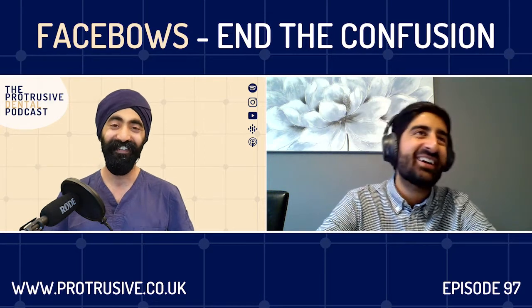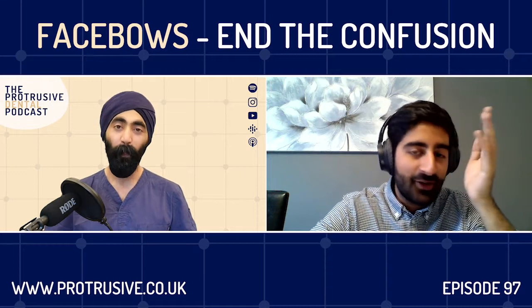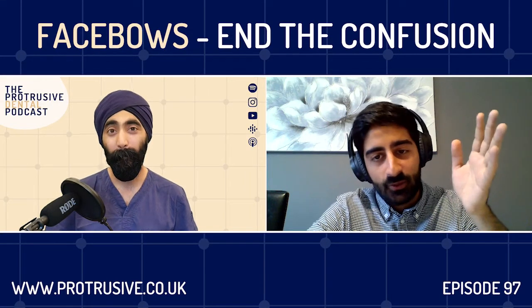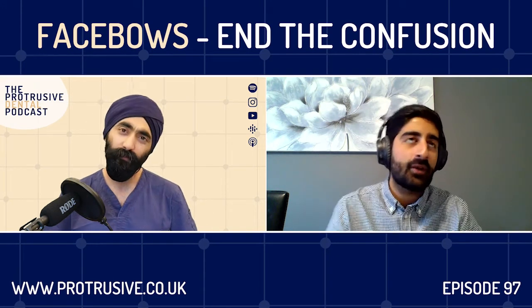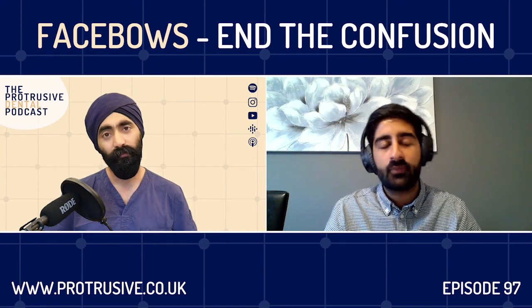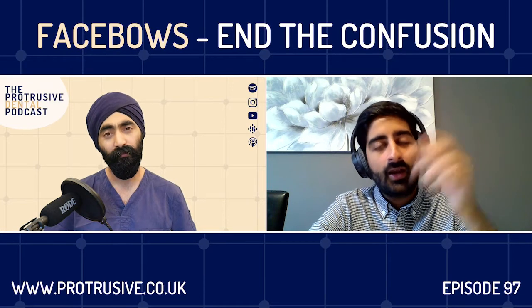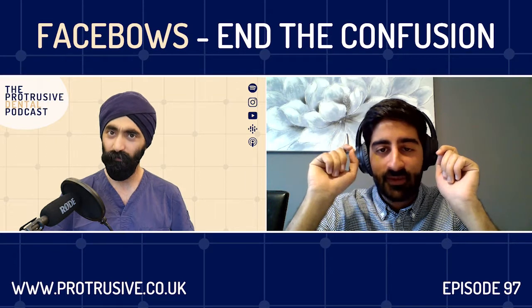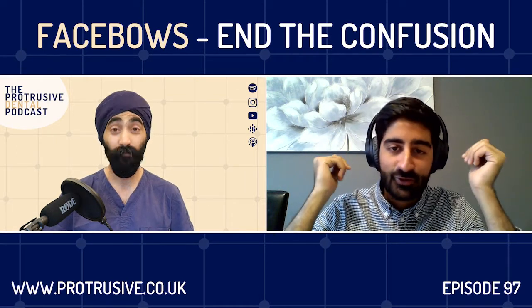Yeah, ivory towers. Jazz, in terms of cants, firstly, there's so many. I've got 9 or 10 ways I measure it within practice because there's different situations that work with these. So I'll just share a few of them that I find really easy. For example, I was prepping an upper 6-unit 3 to 3 bridge a couple of weeks ago, and after I finished, I looked at it and I said, "How am I going to translate this cant to the technician?" And I looked at the canine tips, and I just held my mirror handle across the canine tips. I looked at it, matched the patient's eyes. I was like, that looks about right. I don't need to do anything.